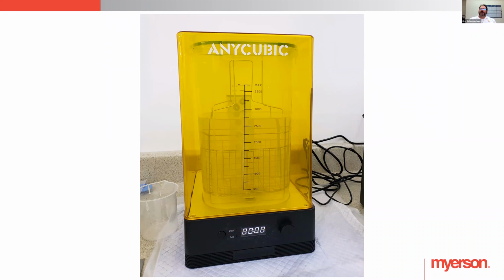And so what I'll do is I'll blow the sockets, I'll blow any very integral areas where I want to make sure that there's no residual resin left there. And then if I do see some of that, or whether I see it or not, I need to go to my clean bath, right? So if I see some of that resin, I'll go into my clean bath. I'll leave it in there for about 20 seconds to maybe 30 seconds. Usually I'll put it in for 20 seconds, I'll pull it out and I'll blow again. And almost 100% of the time when I blow that time, I won't see any of that wetting happen, right? It'll be resin free, there's no residual resin.